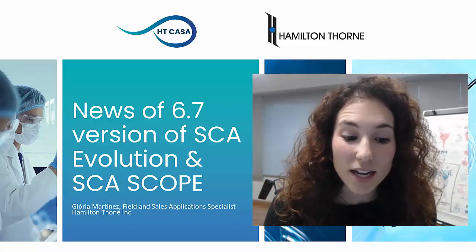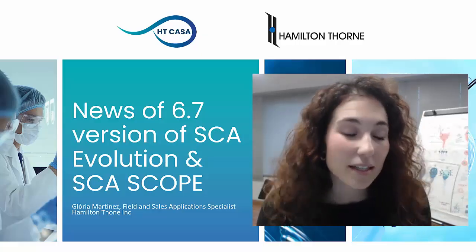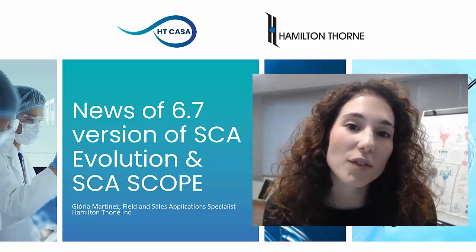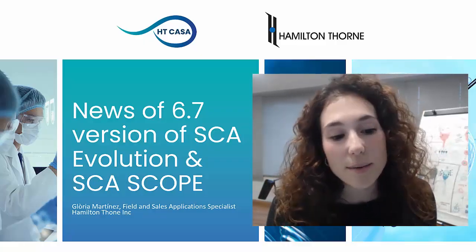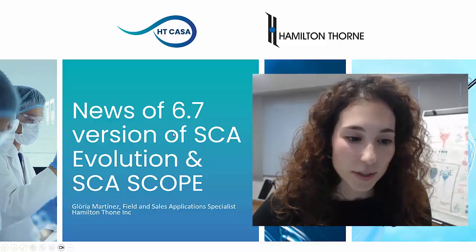I am the Field and Sales Application Specialist of aASA Systems in Hamilton Thorne, and today it's a pleasure for me to introduce the new version 6.7 for SCA Evolution and SCA SCOPE systems.